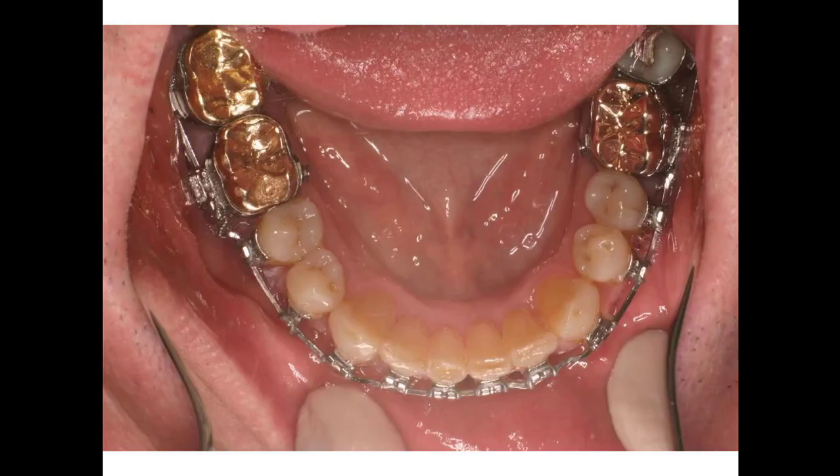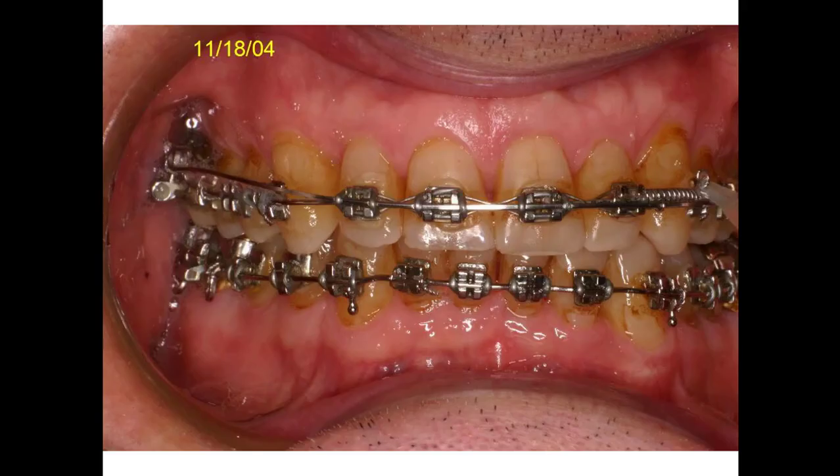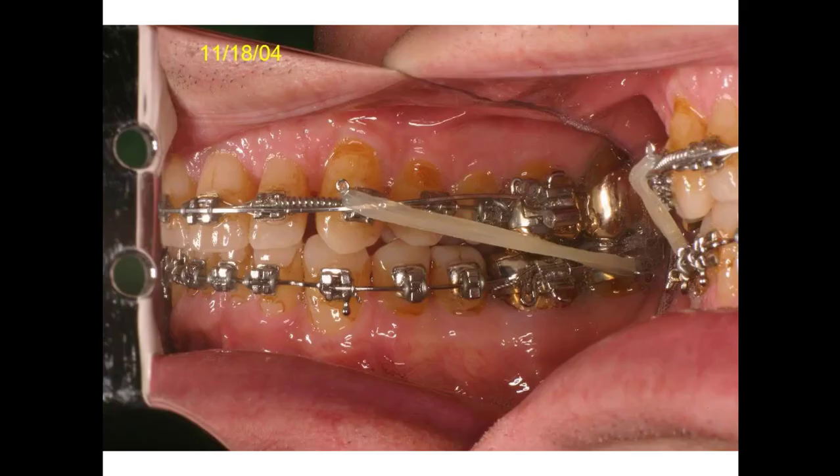The lower looks pretty good - leveled out nicely. We laced that together and you don't see that gap in there, though I'm sure that tooth is real narrow with a little gap back in there. We've come out pretty close to the midline and raised these teeth up to a good height. We've got a little overbite and overjet, which is normal. You slide your jaw forward to bite off something and these teeth don't touch. The intruding arch wire is still on top here. We're a little class two on that side so we put a class two elastic to pull these teeth back into more of a class one relation.